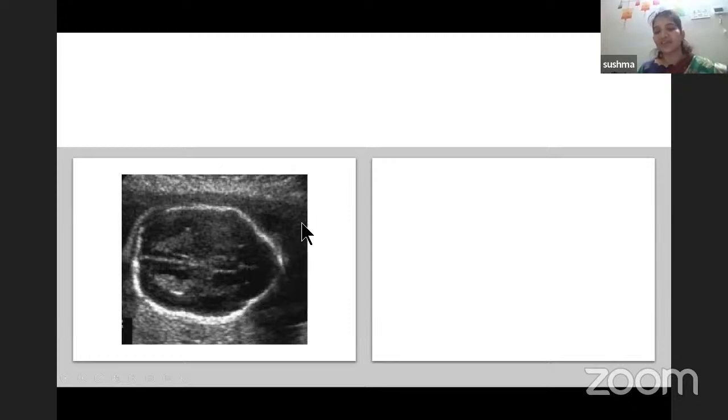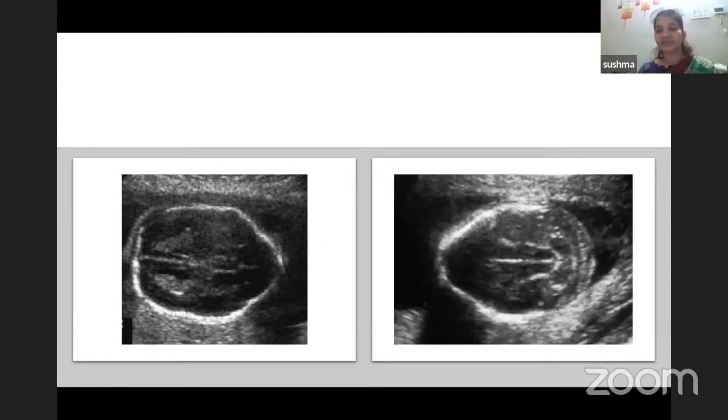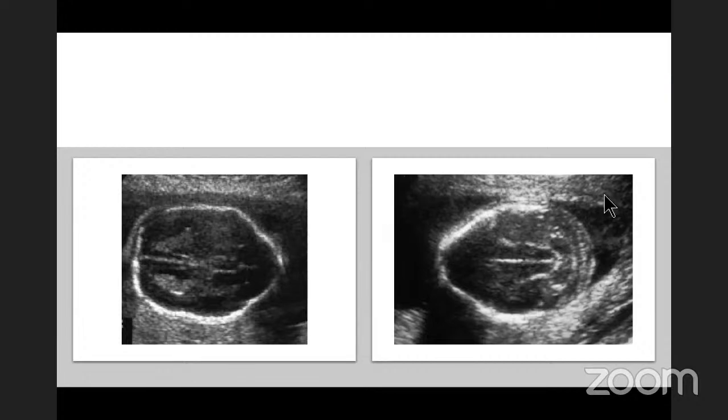Now, you know what is the next sign that I'm going to show. Quickly, I want an answer for this sign that we are seeing here. I'm also pointing out what we are seeing. Did we get any answers? ONTD indirect sign. Very good.